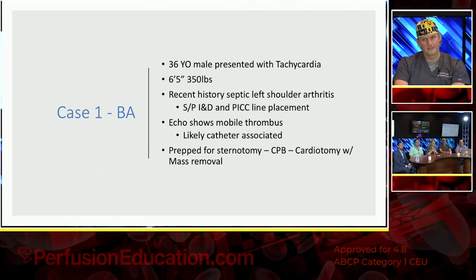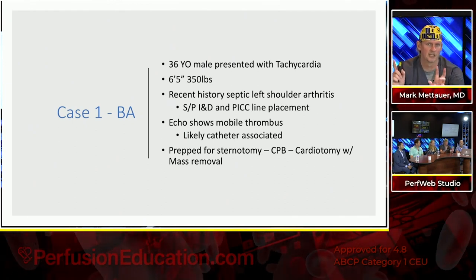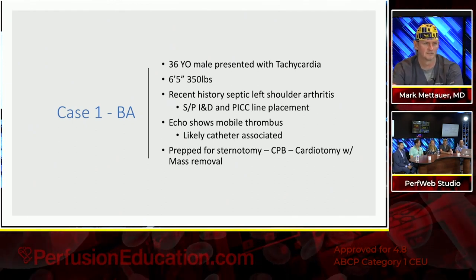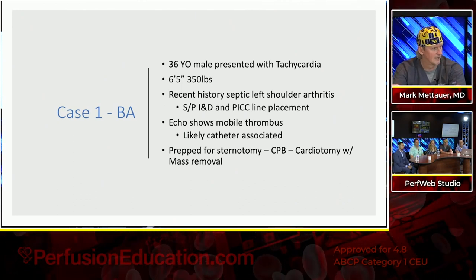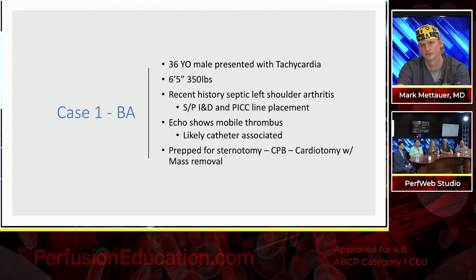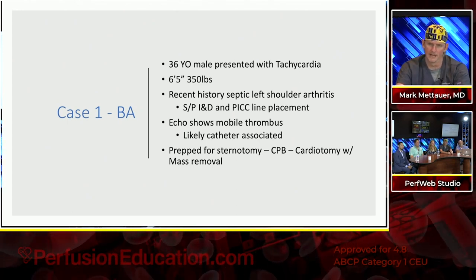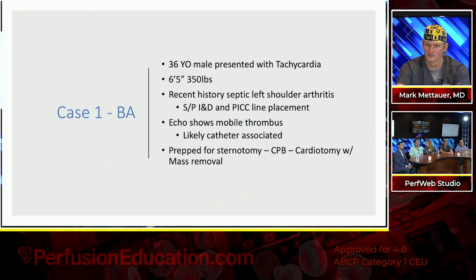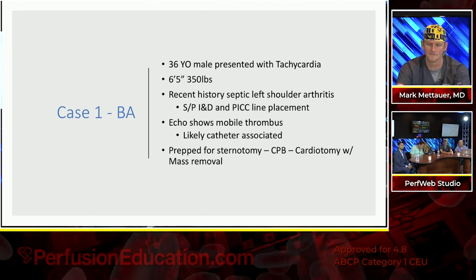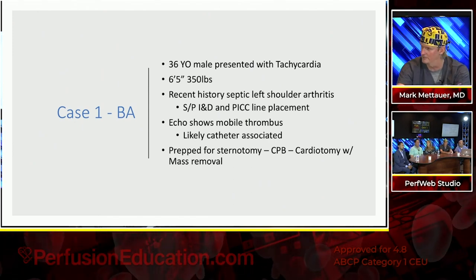At first, when the technology was out, because we weren't checked off on it, so to speak, it was kind of an ordeal to get set up, shipping in clinical instructors here. So now that we've done quite a few cases, we have it on the shelf, and several perfusionists that are adept at starting this up, especially since we do quite a bit of ECMO.